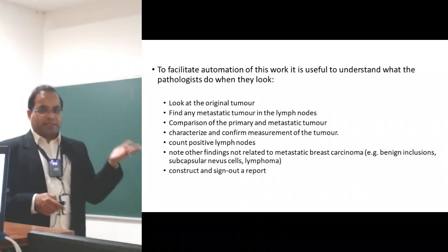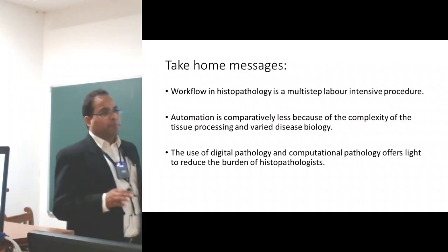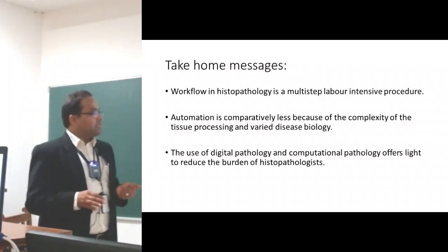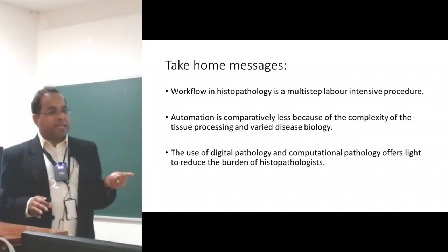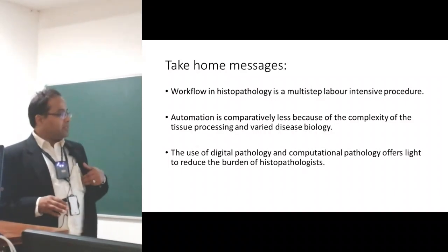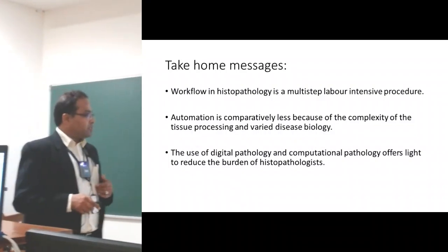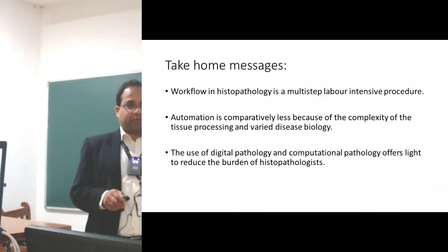So therein lies the hope for the computation. So the take home is that it's a multi-step labor intensive procedure. Its automation is comparatively less because of the complexity of tissue processing and varied disease biology, and the use of digital and computational pathology offers light to reduce the burden of histopathologists.